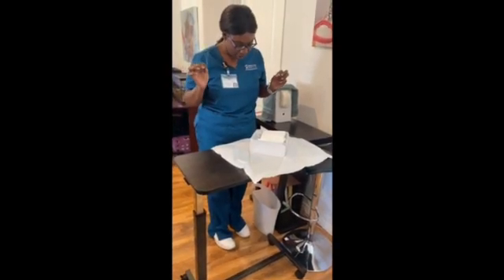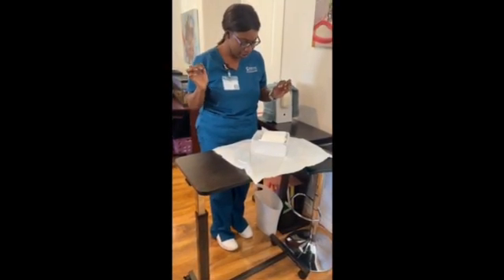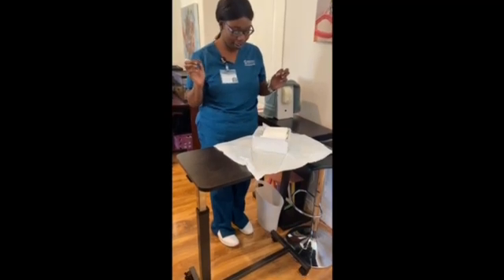Okay, now I'm going to grab the water barrier, which is going to go under Mrs. Taylor.